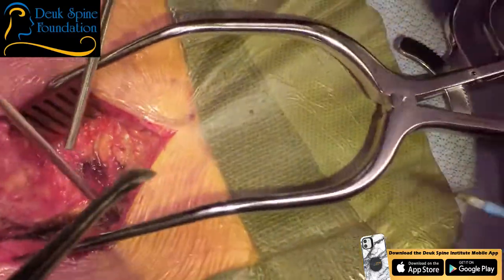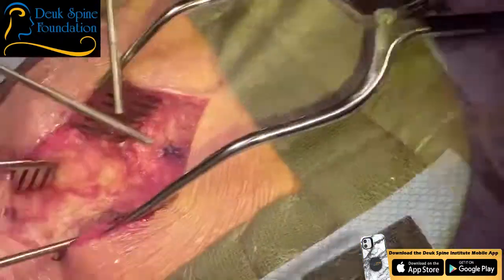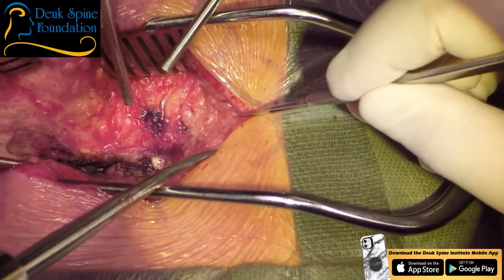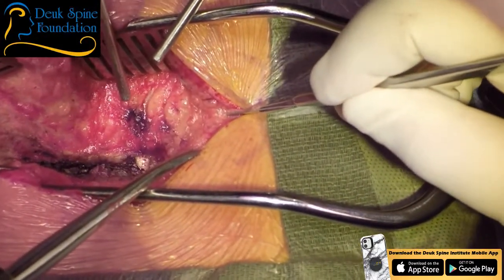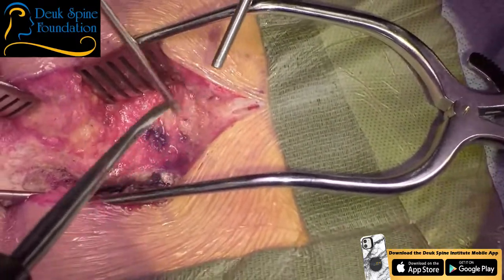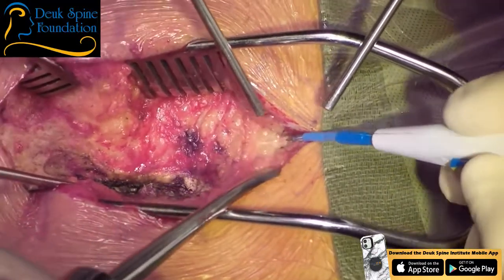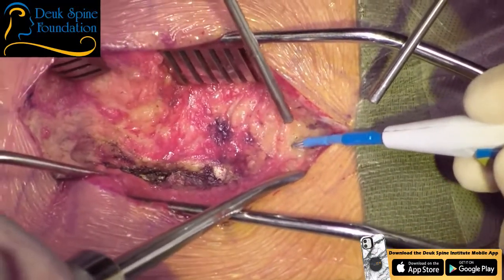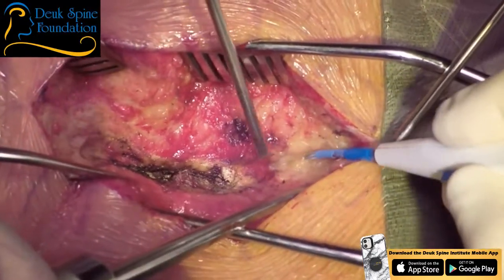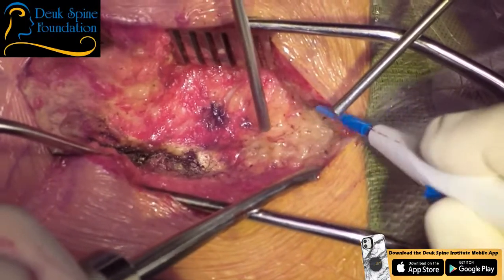Number one, let me have a skin knife. Yes, sir. Number one, if they're isoelectric, then their metabolic needs are not so great. So, in other words, as I retract the muscle, they don't get any blood flow. And just like pushing on your skin, it turns white. Muscles will turn white because they don't get enough blood flow. So if your retractor is retracting the muscles to the side and it's putting more than the systolic blood pressure at that level on the muscles, you're not going to get any blood flow.